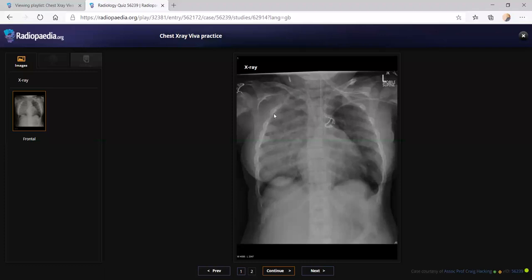And as you told, the ribs are very spatula-like, flattened, so there is some underlying skeletal disorder, and that is associated with a cardiomegaly, some heart disease. In addition to that, the left lung is almost okay, but in the right lung there is diffuse ground glass opacity or airspace opacity. Usually it is seen with unilateral pulmonary edema that usually occurs with mitral regurgitation. You can see that the carina is wider, and there is some straightening of the left heart border, and the left atrial appendage is also enlarged. So mostly that is due to mitral regurgitation causing unilateral pulmonary edema.